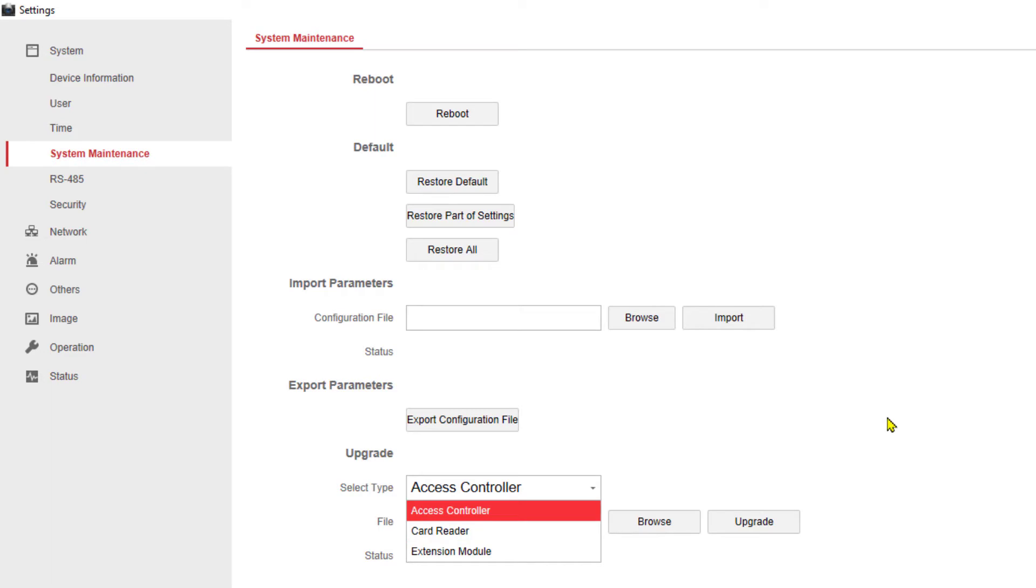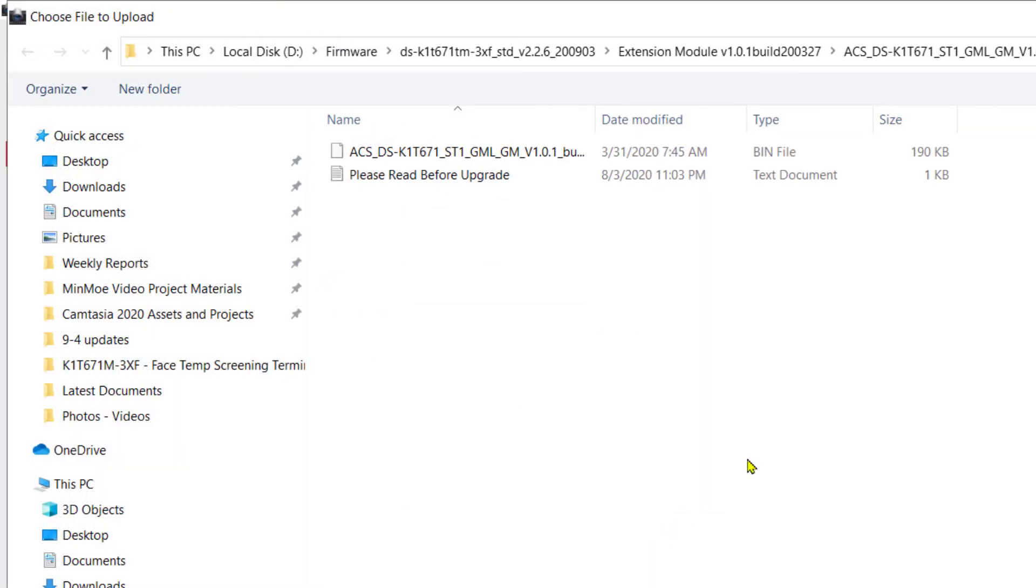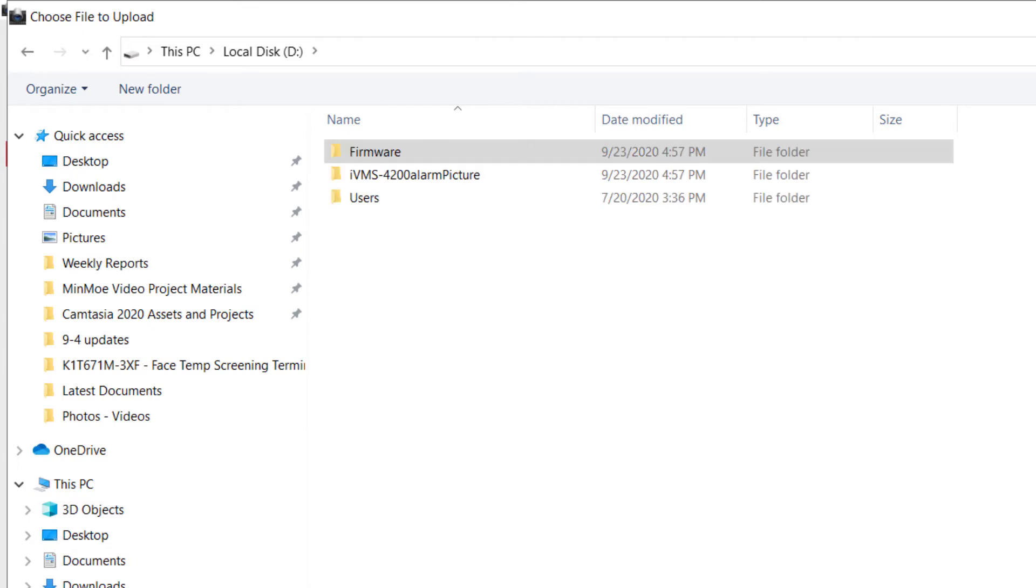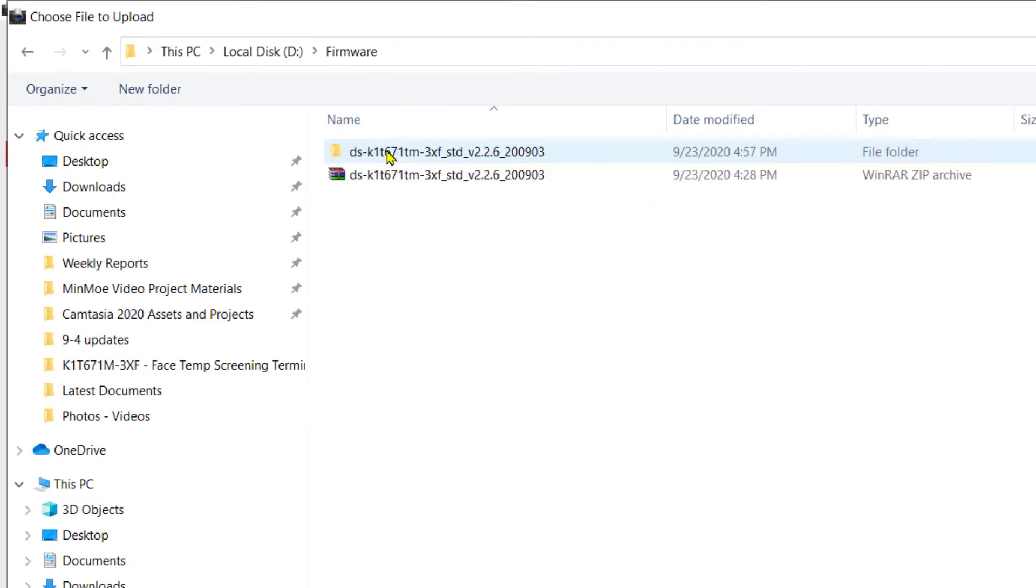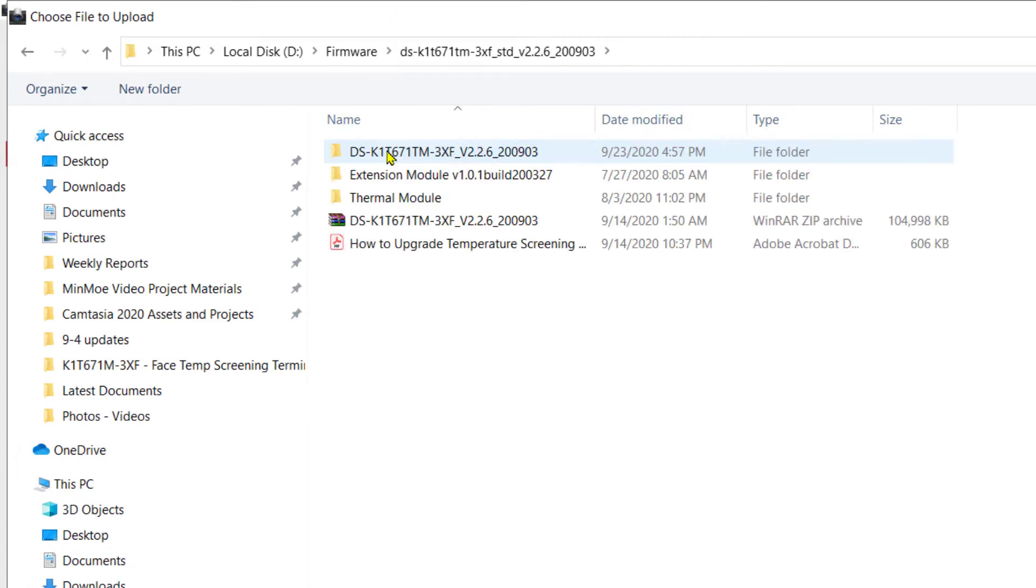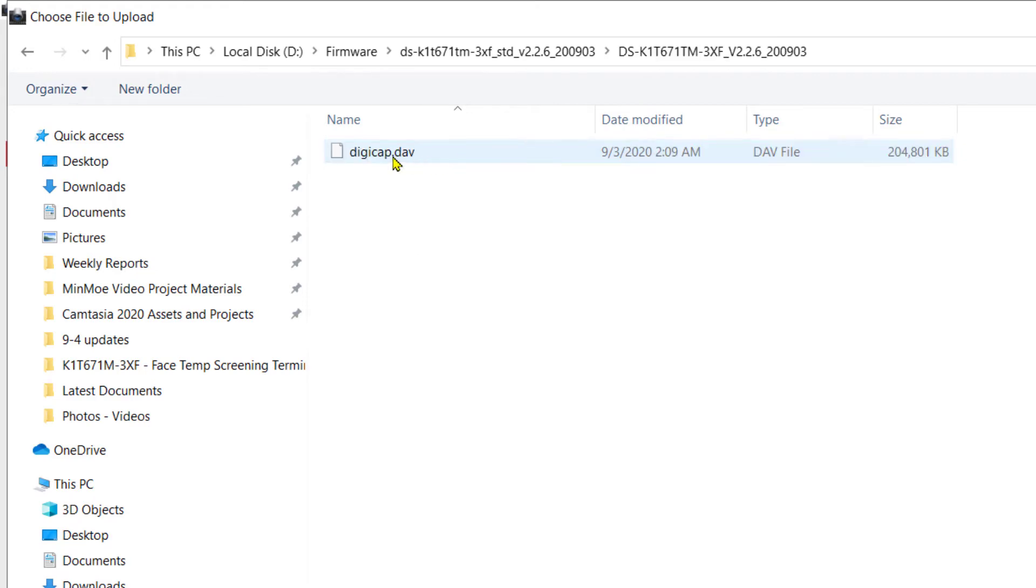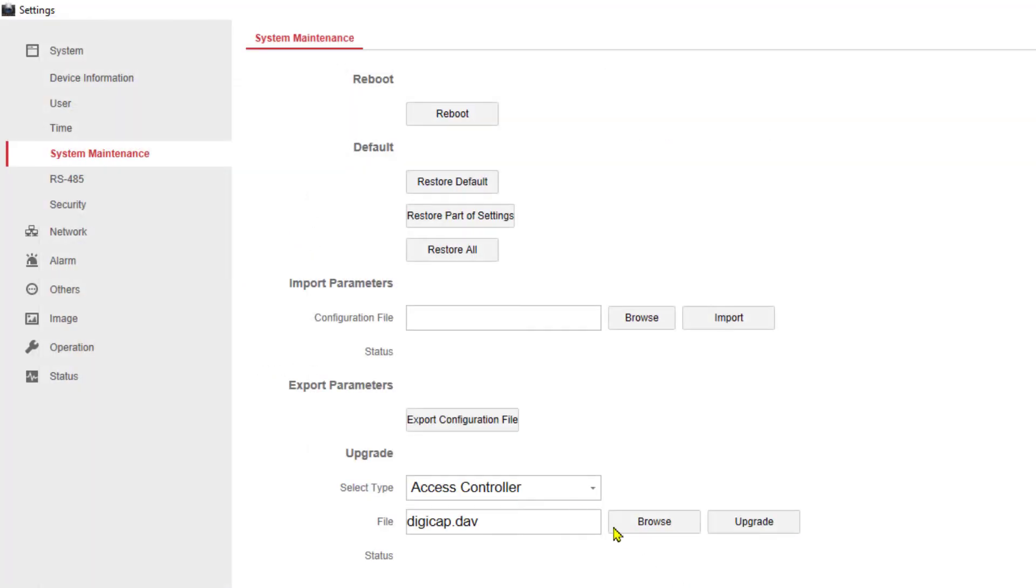We're going to be doing two upgrades under the access controller section and one upgrade under the extension module. So all we have to do now is browse to our firmware files, which in my case again was on the D drive under firmware in this folder, and this is the main software right here. I'm going to go ahead and choose this digicap.dav, click on open. I have access controller digicap.dav, click on upgrade, and the system will go through the upgrade process.